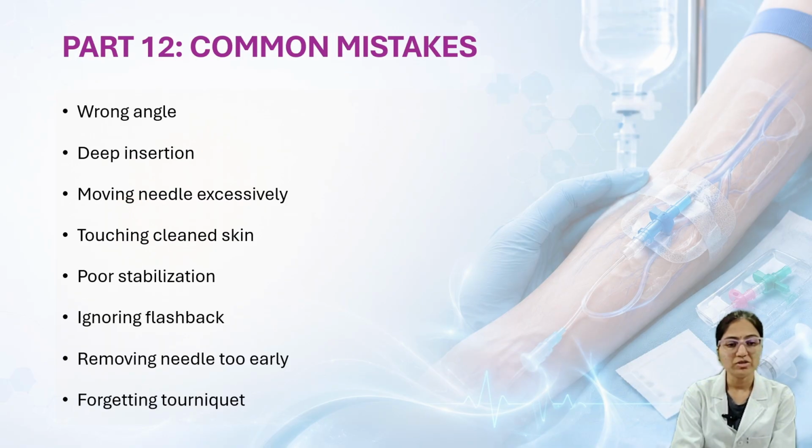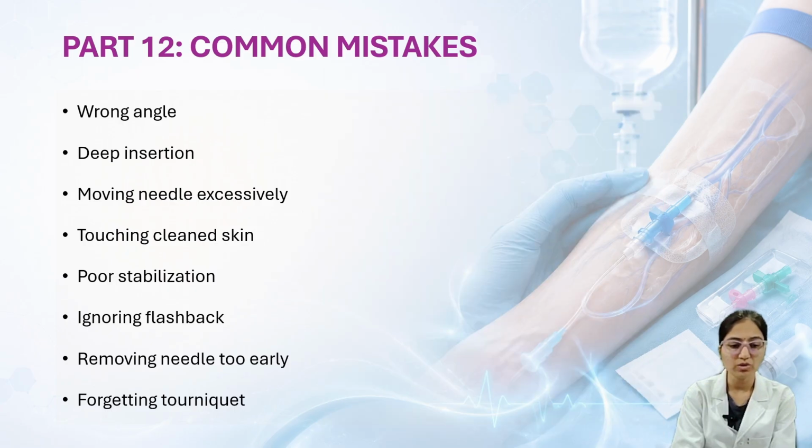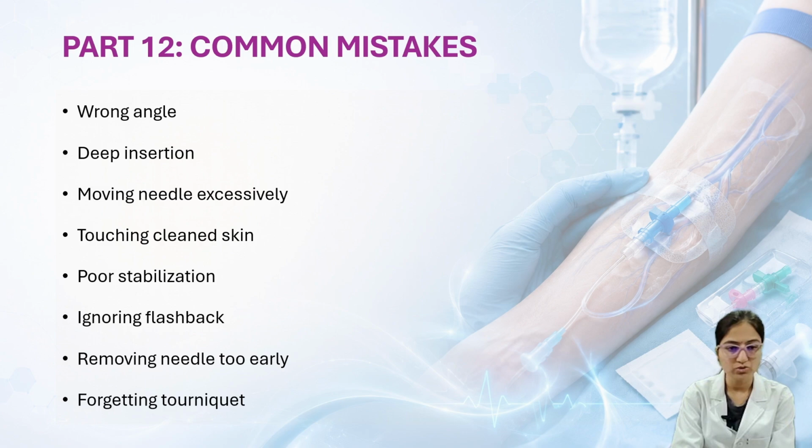Next, common mistakes. Some persons make these: wrong angle, deep insertion, moving the needle excessively, touching cleaned skin, poor stabilization, ignoring flashback, removing the needle too early, and forgetting the tourniquet. These are the common mistakes we should stop.